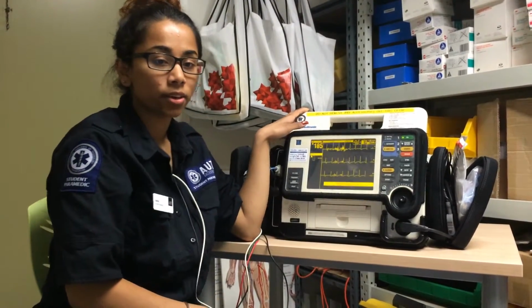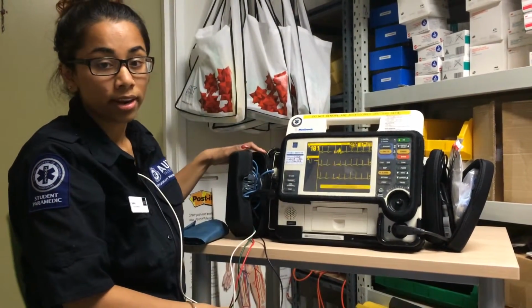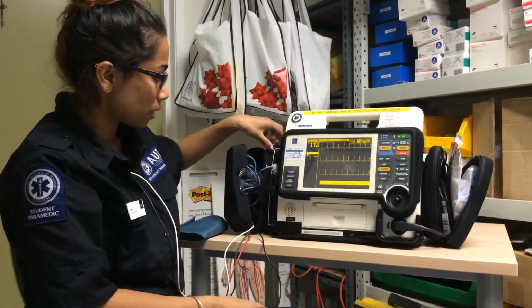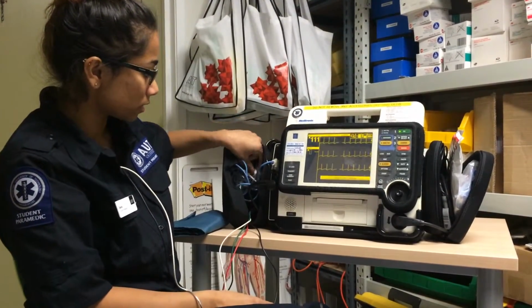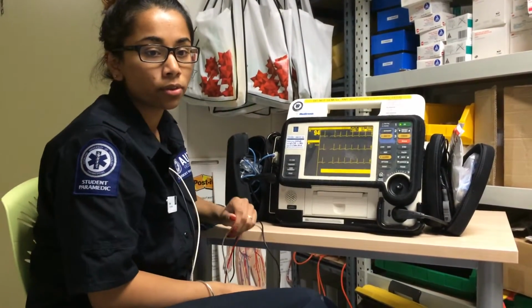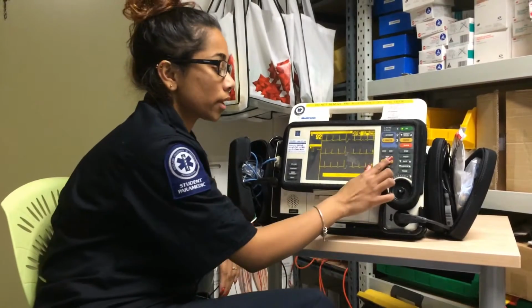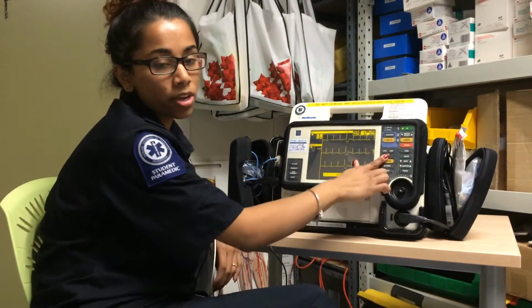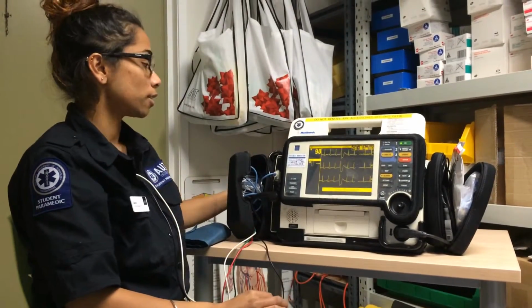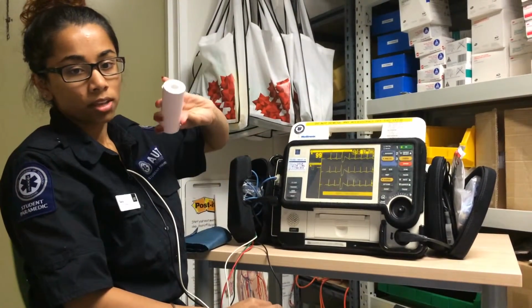So the ETCO2 detector is located in the right hand pouch, and it gets installed into the ETCO2 port here on the LifePak. So this is the ETCO2 itself, and also the non-invasive blood pressure button is located here on the LifePak 12. Also, to change the ECG paper, there should be a spare roll located at the back of the LifePak, like so.